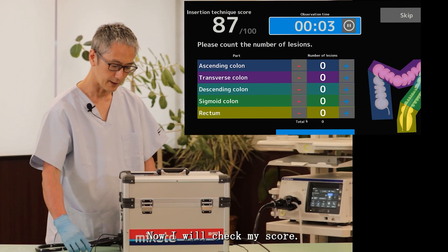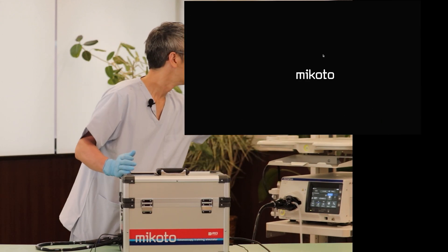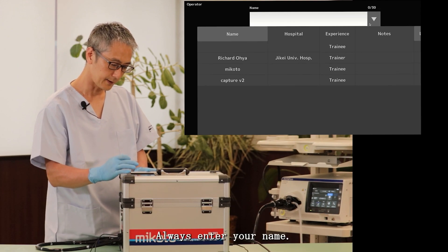Okay, now I will check my score. Always enter your name.